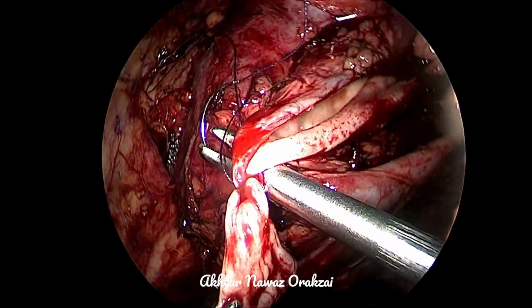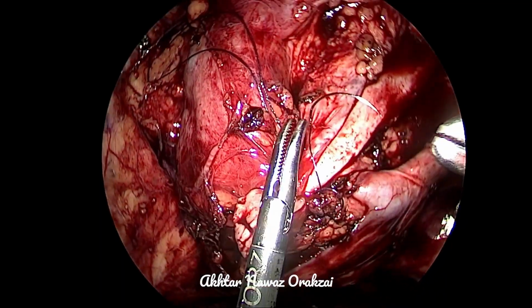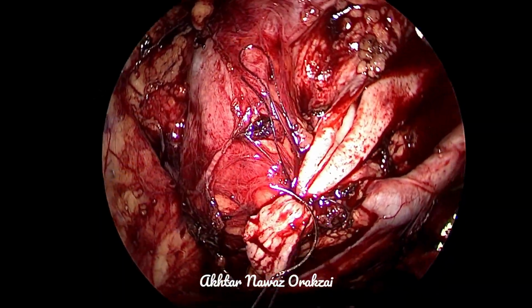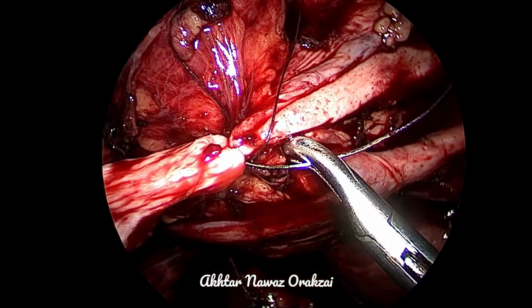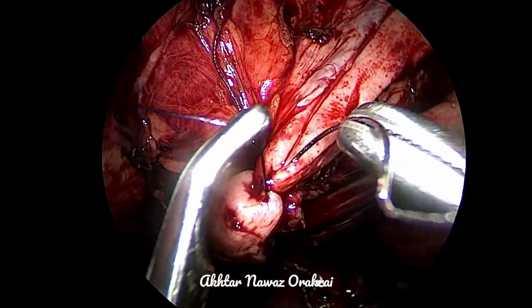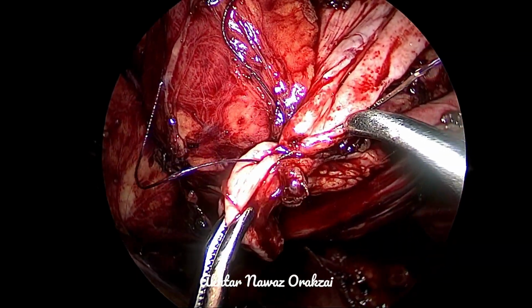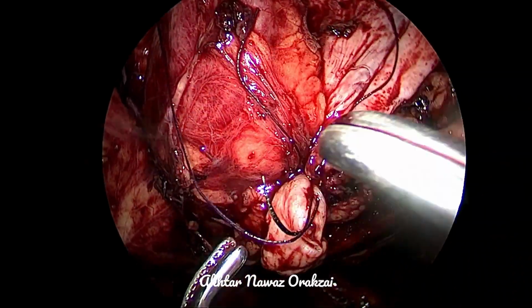And then we pass the suture below the first knot, and we are going to make the needle pass through the edge of the ureter to the inside, and then we repair the ureter and the pelvis from the inside.